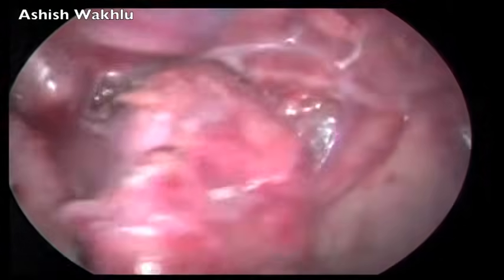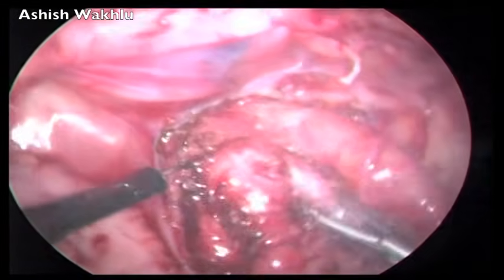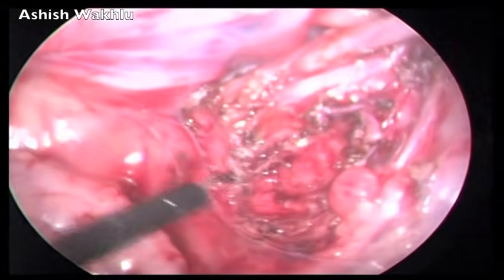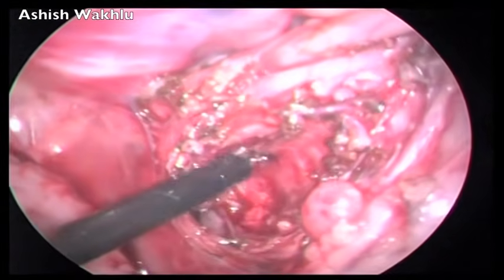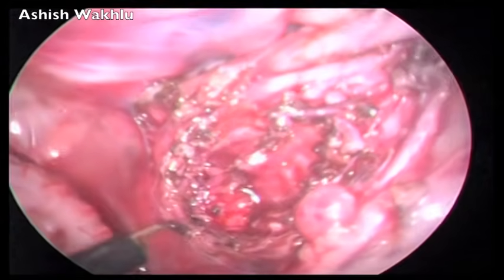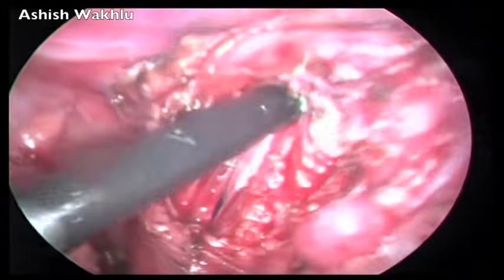As you can see, the size of the bowel due to dilatation makes for somewhat difficult handling, but there is no quicker way to do this rather than to keep patience and keep dissecting until sufficient mobilization is achieved.